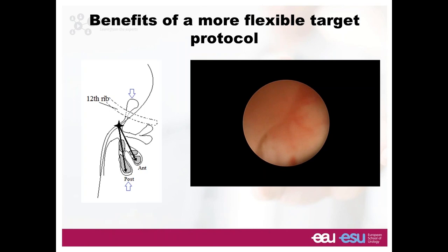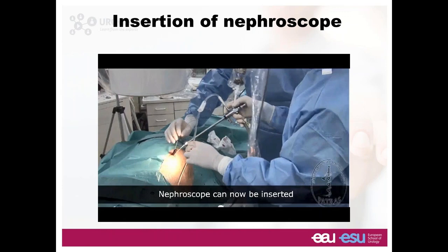You start coming closer to create space for your scope to go inside without tearing anything — very gently, because the water injection creates the whole situation by itself. Lithotriptor in again, you create space, and it starts working nicely. Gradually you go in with your scope — everything is trapped. You don't need graspers; you just go in with your lithotriptor and aspirate. It's very important to have a lithotriptor with suction — you go in, break, and aspirate. In a few seconds you clear the stones and there's no way they can escape.